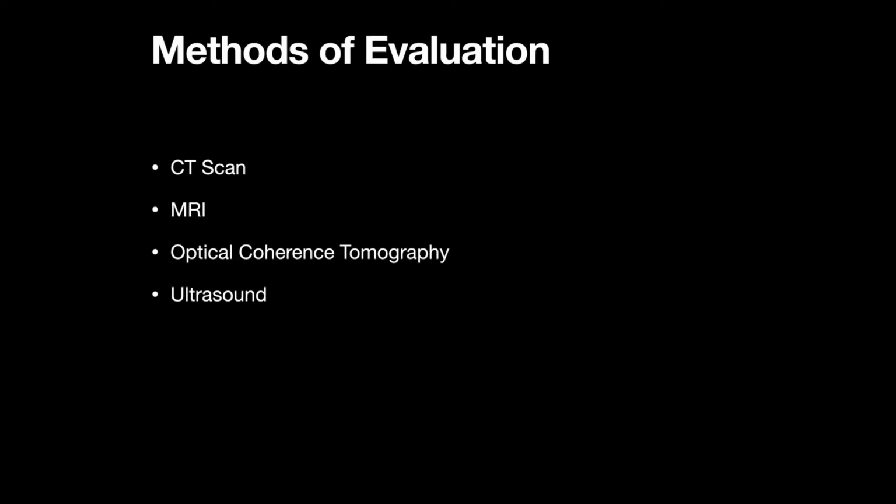OCT, optical coherence tomography, is a great view. It's a cross-sectional view of that posterior aspect of the eye. But again, it's not available to me in the ED. This is an ophthalmology specific thing. And so ultrasound really rises to the top as one of these adjuncts to my exam to help round out, no pun intended, the view of the back of the eye. Because it's obviously portable. The whole idea of point of care ultrasound is portability. It's safe, it's reproducible, and it provides a lot of benefit and utility to our patients.